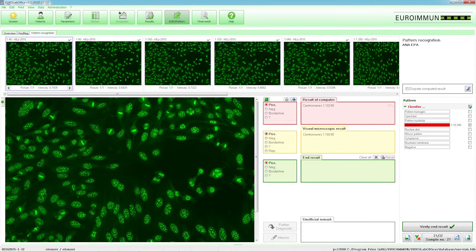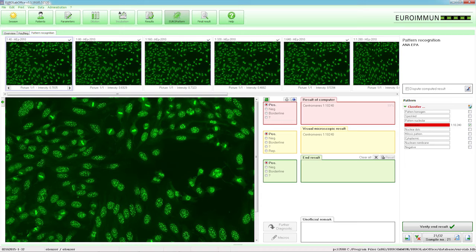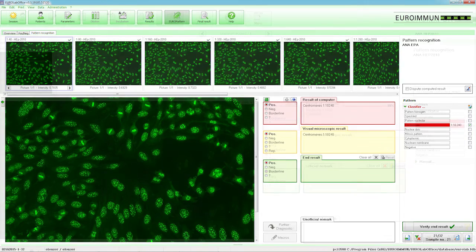These fields act as an audit trail between the Europattern, laboratory staff and the LIS system.